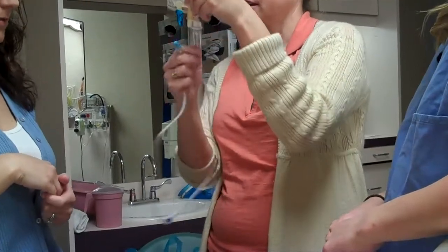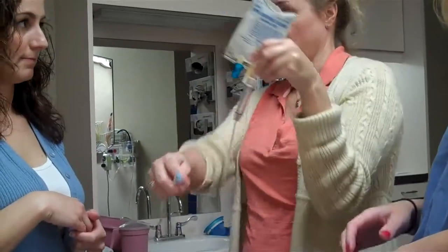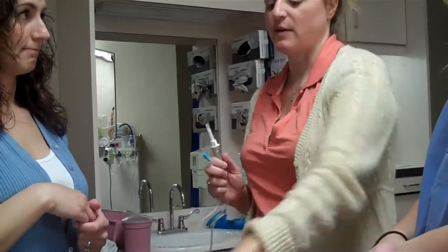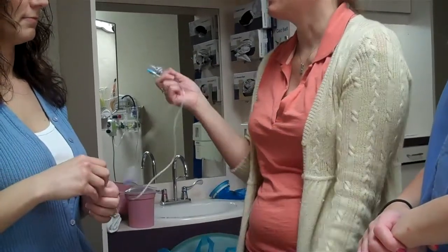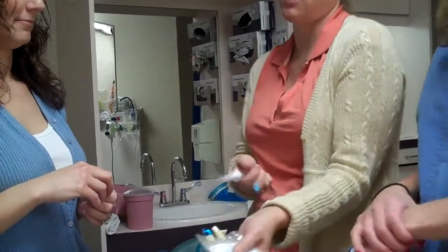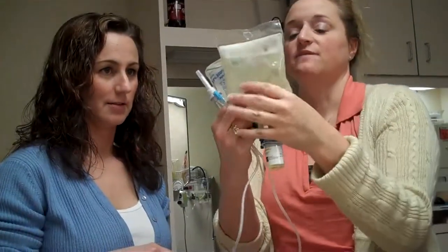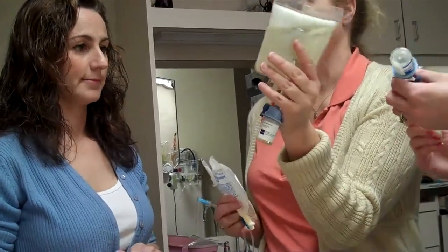You're going to spike, squeeze the chamber half full, prime your tubing, and then go to him and hook it up. They're both the same infusion-wise, but that one you have to prepare ahead of time. Say you forget and his medication is due and you didn't prime that. You can see already how much of the fizz has gone down. In 45 minutes, this is givable.